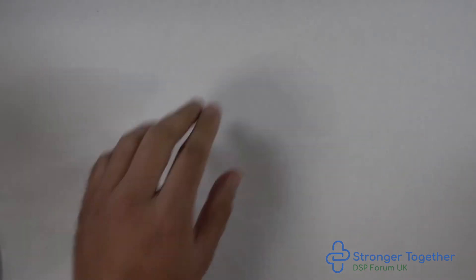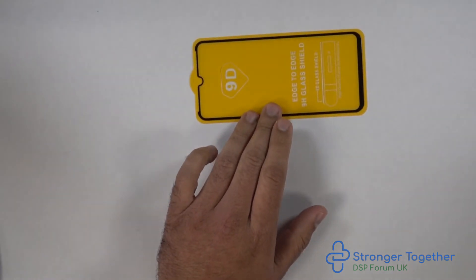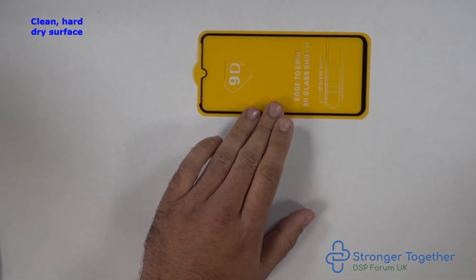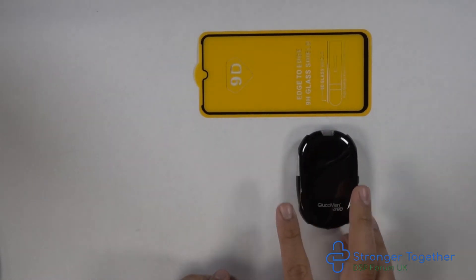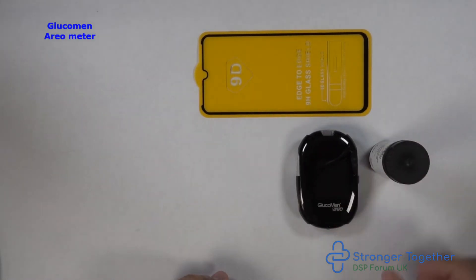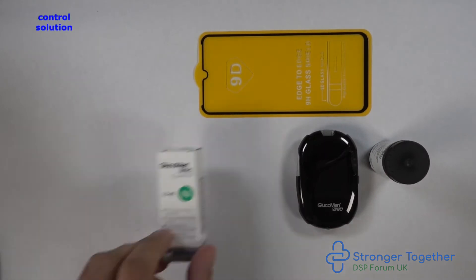Now let's show you how to perform a control test with both meters. You need a clean, hard, dry surface — here I'm using a mobile phone glass screen protector, but you can use any clean, dry, hard surface. You will also need your Glucomen Aereo meter, your test strips, and the control solution.